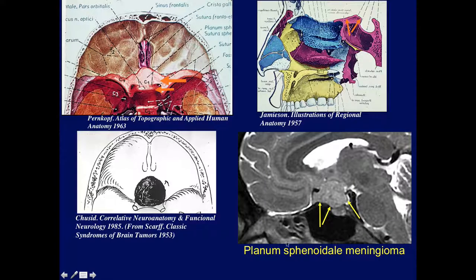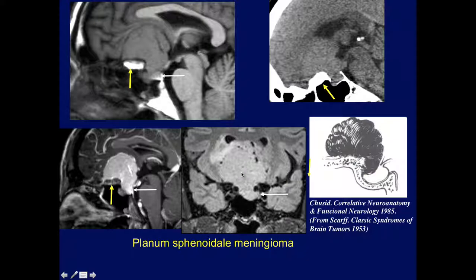Here's a larger planum sphenoidale meningioma that has grown posteriorly, now overlying the sella — still really a planum meningioma because it started over here. They get larger. Here's an even larger one with tremendous hyperostosis. This tumor has now invaded and is lying on top of the pituitary gland on the coronal. See the tumor here — here's the pituitary — with all the hyperostosis and irregularity of the bone. The tumor over the planum has filled part of the pituitary fossa.